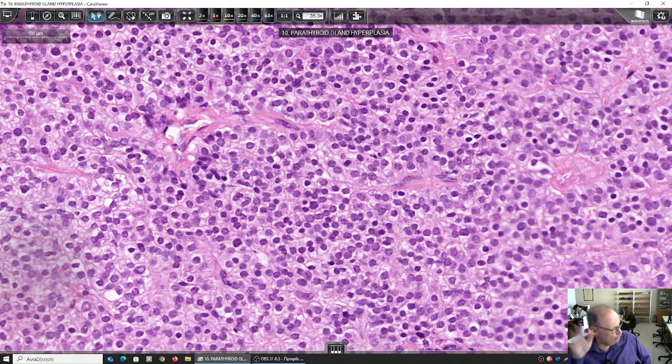If it is a lesion of more than one gland, this is hyperplasia. If it is a lesion of one gland, there is a possibility that it is a parathyroid adenoma, but it should have a rim, and you'll see the normal part of the parathyroid, which will have not just one cell population, it will also contain some fat cells and oxyphilic cells, and then you'll have the adenoma that consists mainly of chief cells as this one. But this is probably hyperplasia of parathyroid.